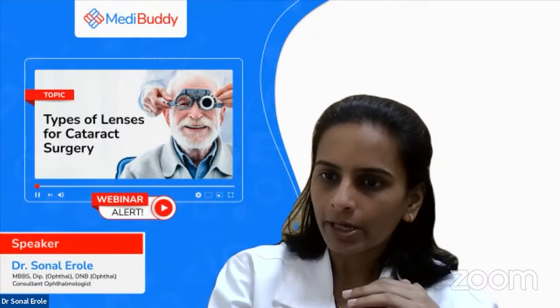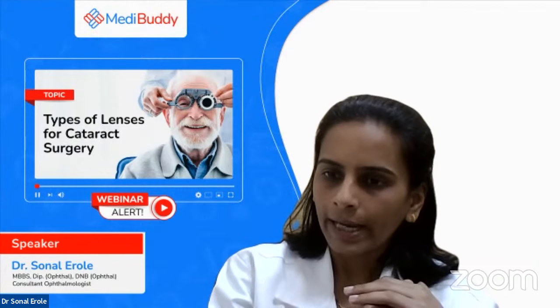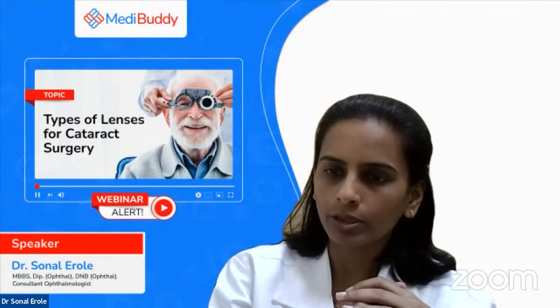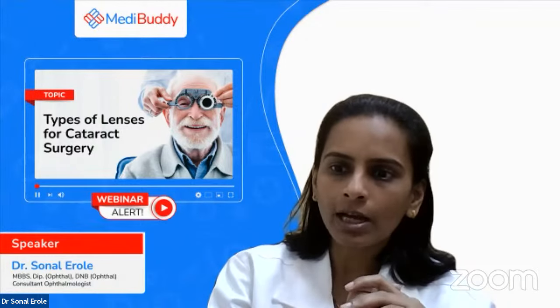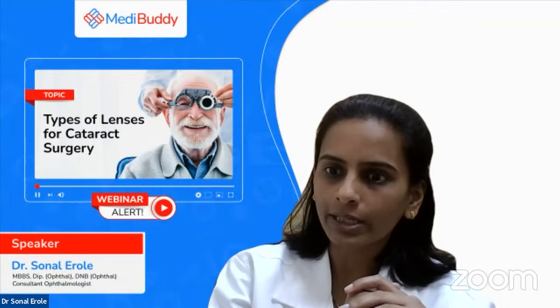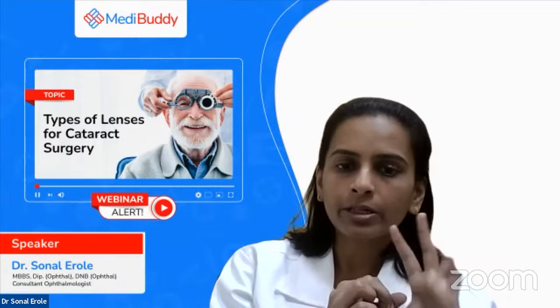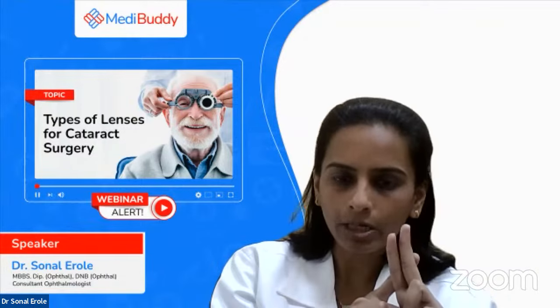Money is not the criteria, which is the best lens and solution available. I suppose this question is about the intraocular lenses, because we are not using solutions for the intraocular lenses. We are putting them surgically and they are inside the eye, so we do not need to change these lenses. So if money is not a criteria, definitely trifocal lenses or the extended depth of focus lenses are available.